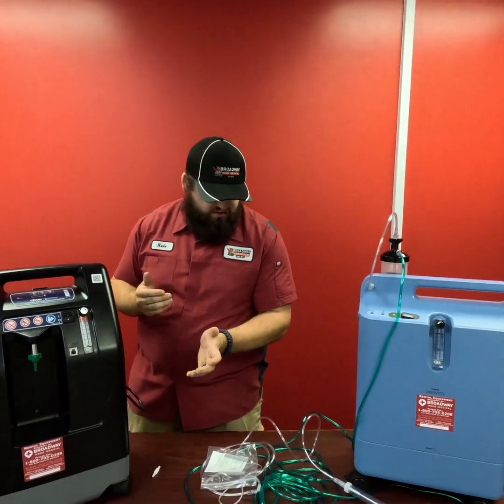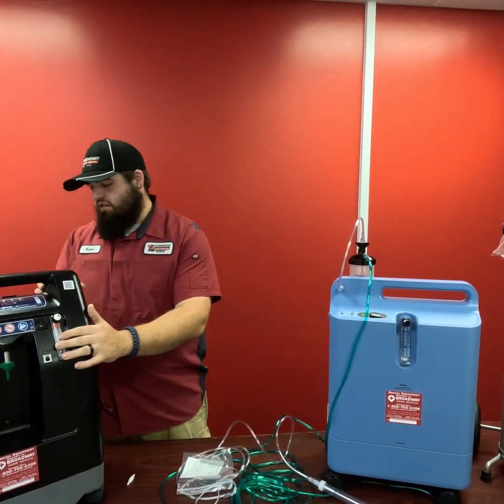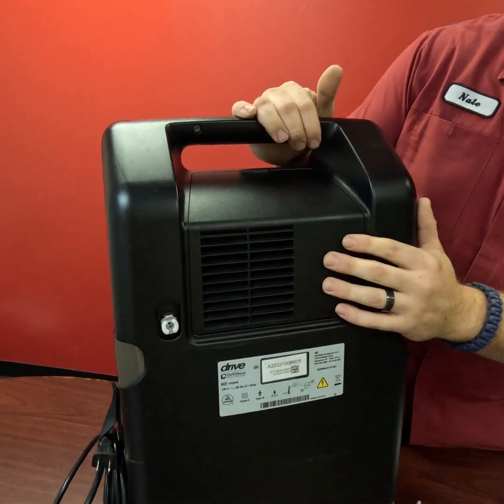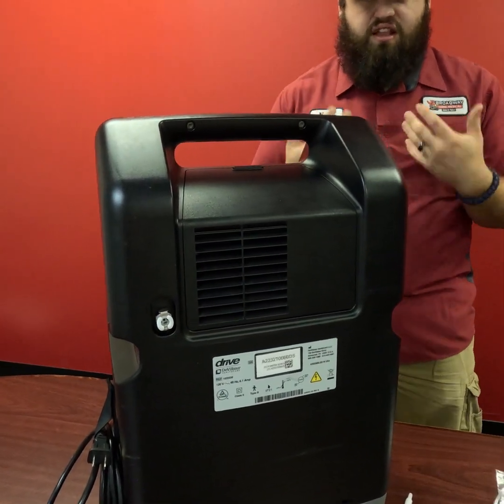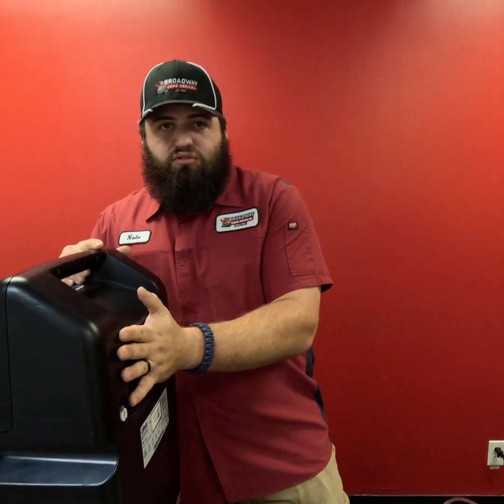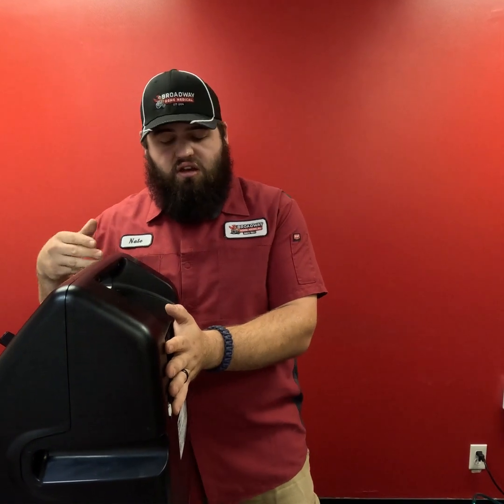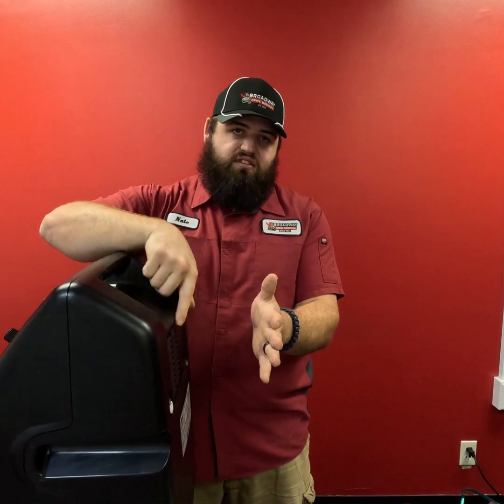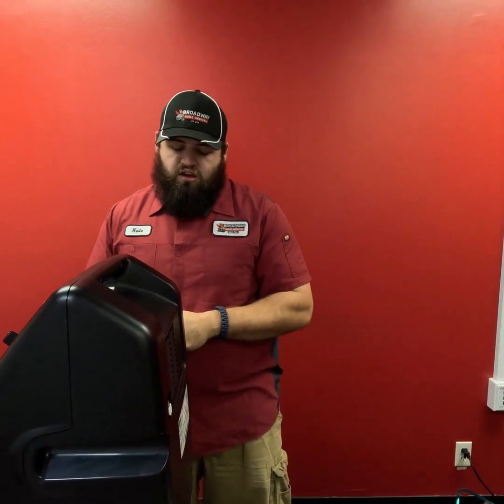But from there, like I showed before on the back, these machines do have vents on the back. This is where they pull in all of their air and how they circulate. We do always want to make sure that we're keeping these machines at least 3 to 6 inches away from any walls. If you put this machine straight up to any wall, it won't be able to properly circulate. So you do always want to make sure that you have some room behind it so that this machine can still pull air in through the back.